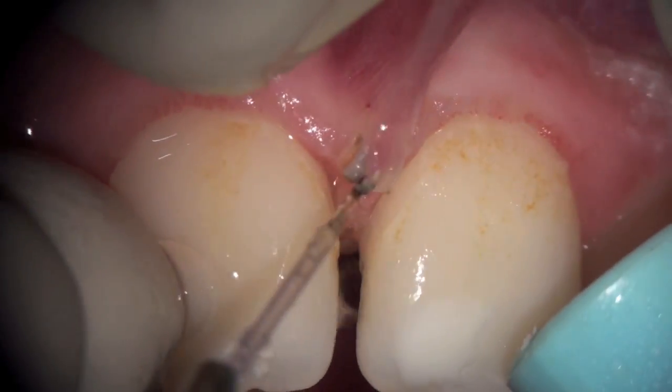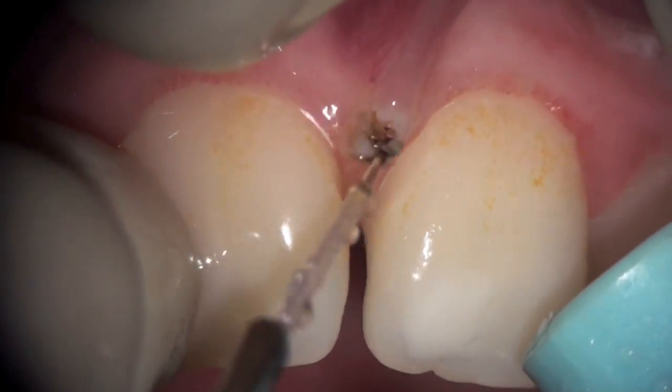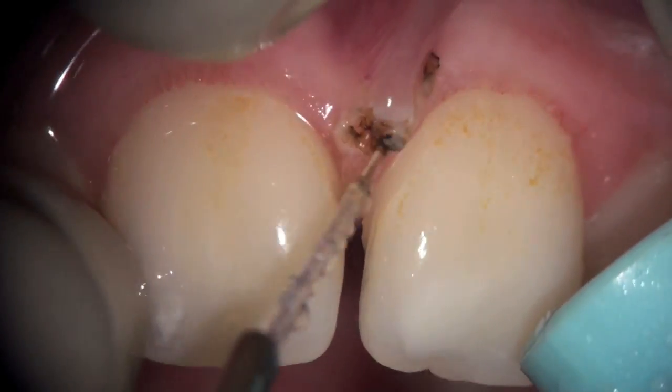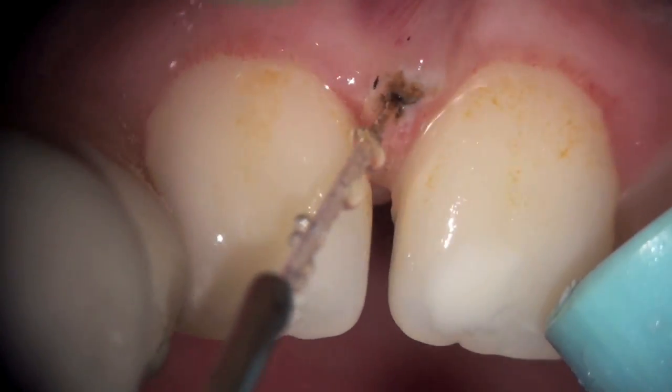We're lifting up the attachment, pulling the upper lip with our left hand, and cutting with our right. As you can see, we're slowly creating an initial cut that will eventually become diamond-shaped.